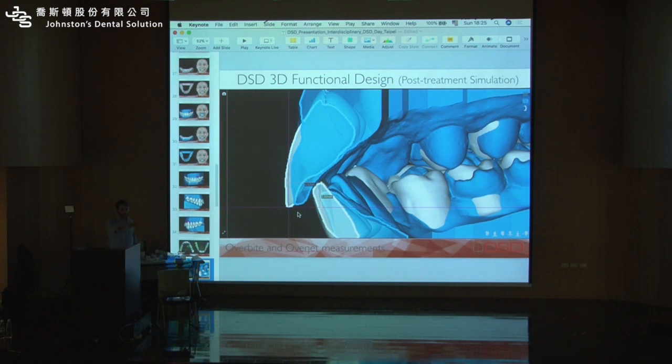Somebody was asking, you were asking me. Who was asking? I think the guys from Vietnam. About how much we can lengthen the centrals. This is the image that helps you. Okay? On his case, his face is not asking the centrals to be longer. He already has a lot of exposure.